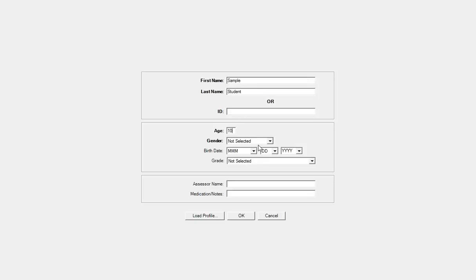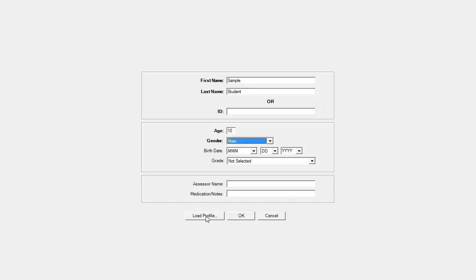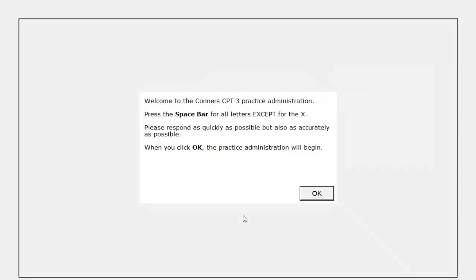If you are retesting someone that you have previously tested with the software, you would select Load Profile and then select the correct respondent from the saved profiles. Once you select OK, you are brought directly to the one-minute practice test.